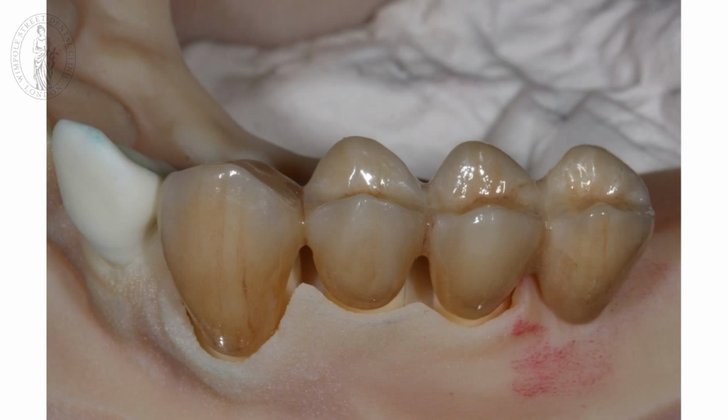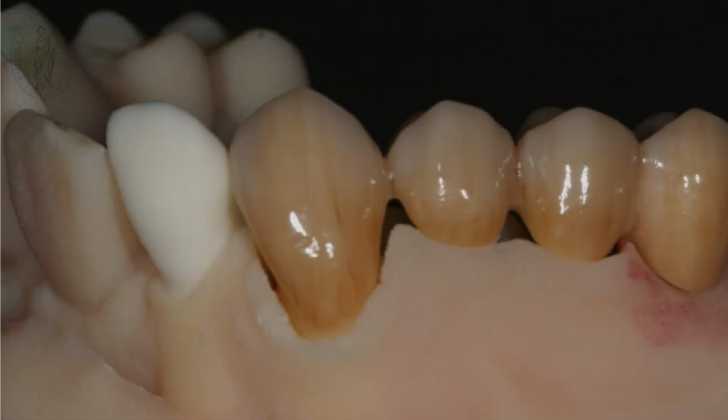And this is a bridge. This bridge is not veneered with anything. This bridge is just painted. I think the technician has done wonderful work here, and you'll see if we fit this bridge into the mouth, it blends in absolutely perfectly. So you can see the bridge here.